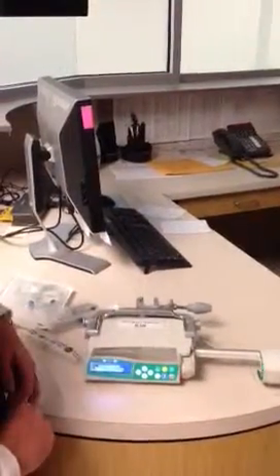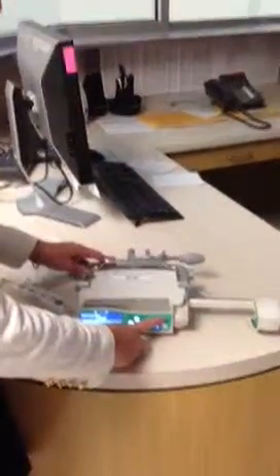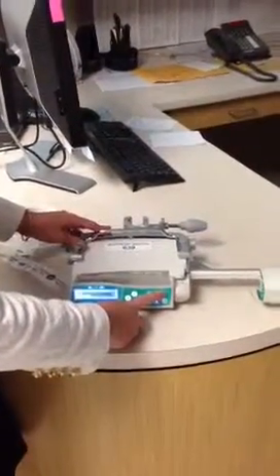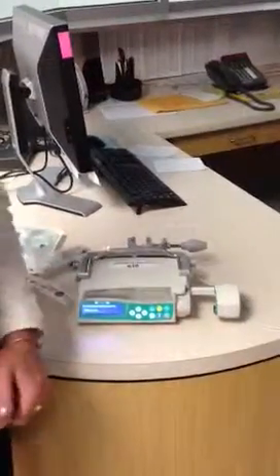Close your pump syringe arm and power off your pump by holding the on-off button for three seconds. When that occurs, your drive arm will come into place and your pump is shutting down.